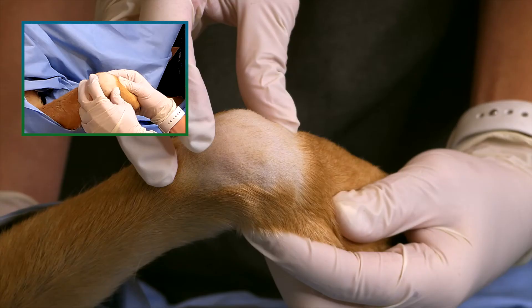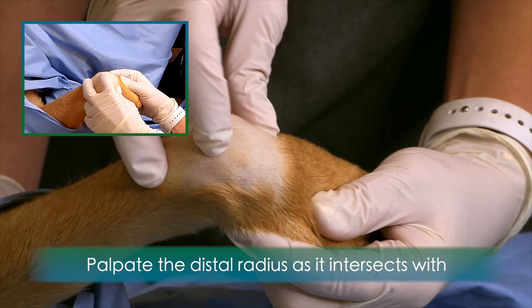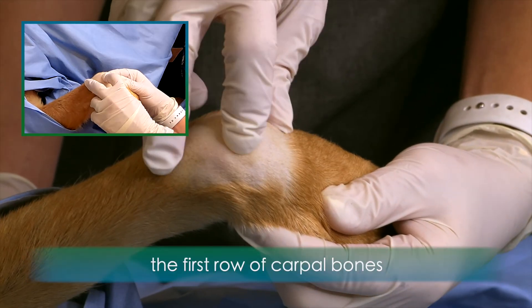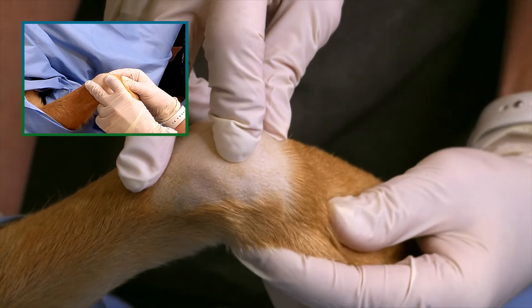To perform an injection of the canine carpus, begin with the carpus in 90 degree flexion. Palpate the distal radius as it intersects the first row of carpal bones. Flex and extend the carpus to palpate the joint space.